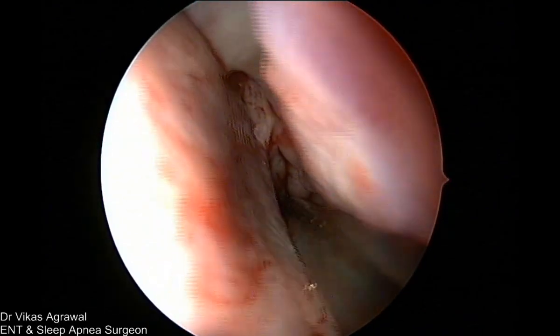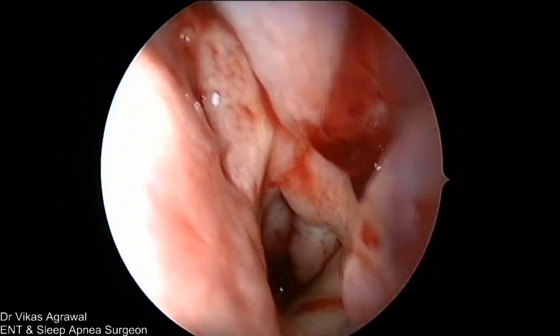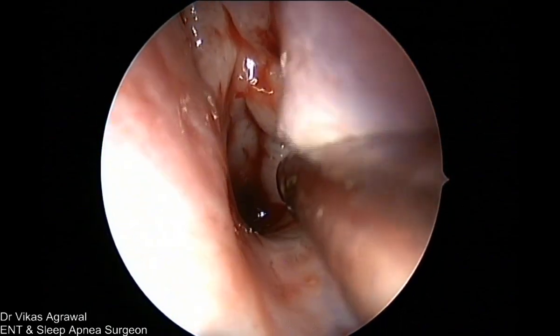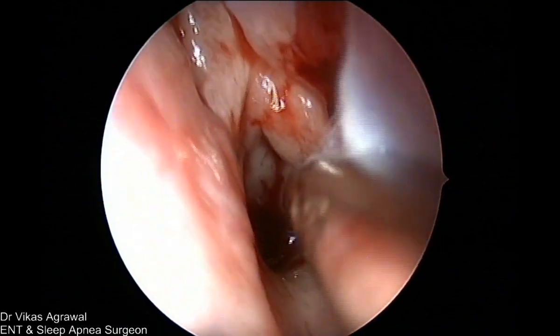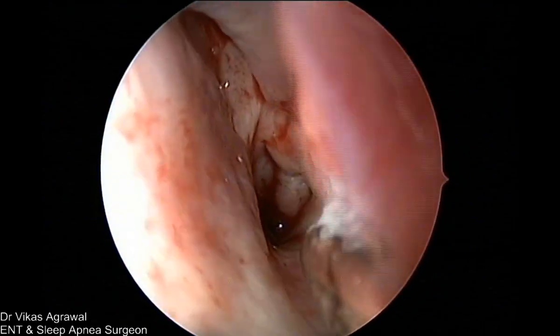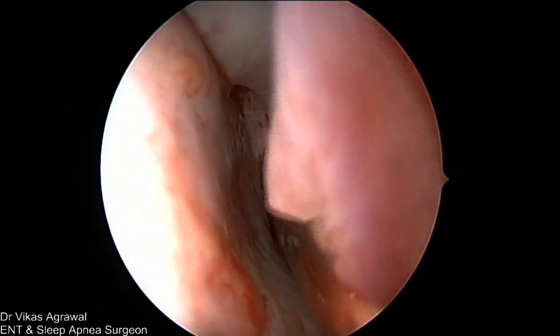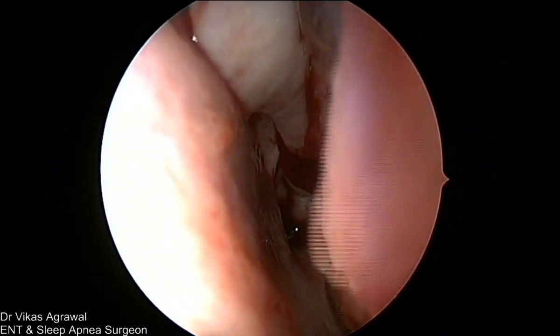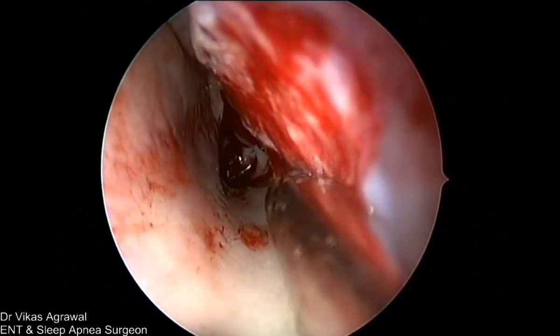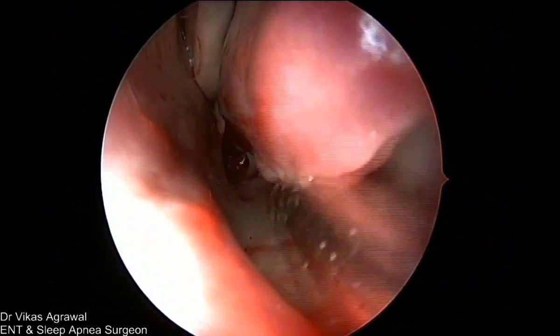Same thing I'll do on the other side. You can do a simple channeling as well, but I'm just showing this that you have seen many a times. I'm showing you something new which you can do for bigger turbinates. As we said that this is only polypoidal. Now this is a simple regular 0-degree blade of Medtronic shaver. So this mucosa is absolutely not useful. It creates problems. And if the bone is big, I'll remove the bone also. But here the bone is not really big, so I'm not removing the bone.